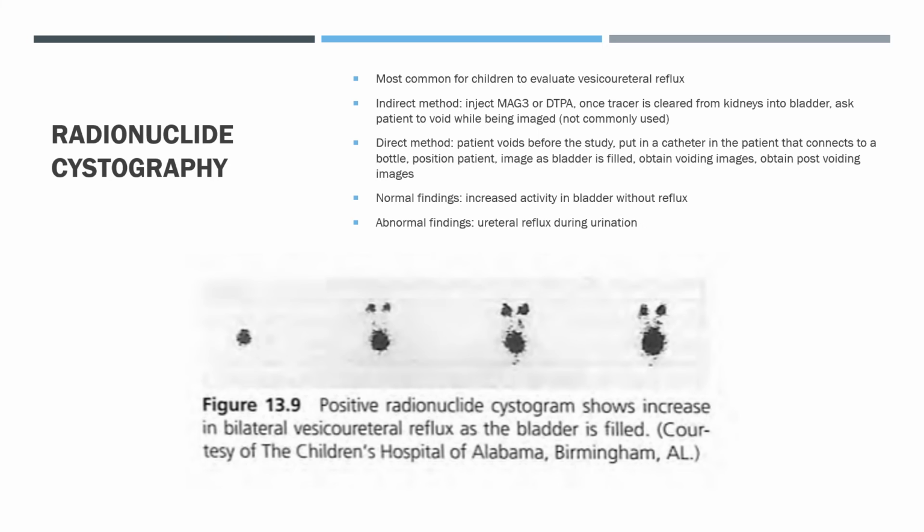What I have seen is the direct method, where it's kind of sad to watch sometimes because the kids, of course, one, don't like having an IV started on them, which you have to do first, and two, they don't like to have catheters put in. Sometimes they're put to sleep, and then you have to have a doctor come in and do that. I've only seen that once, but being in medicine, we have to get used to these sorts of things. I wouldn't say we ever necessarily become numb to them, but just make sure to control the room, if that makes sense.